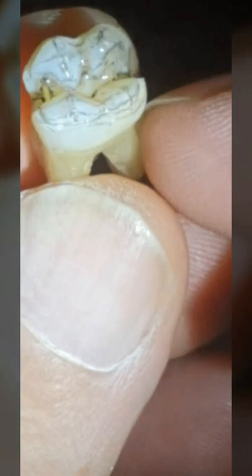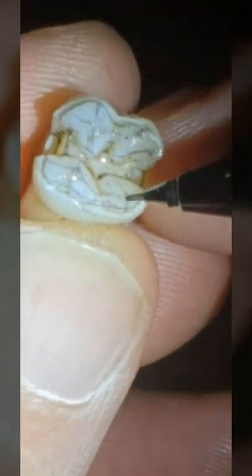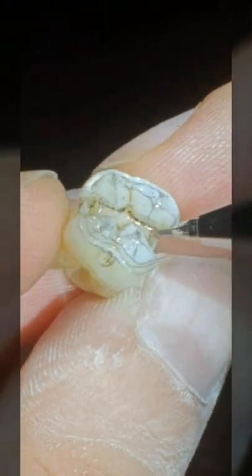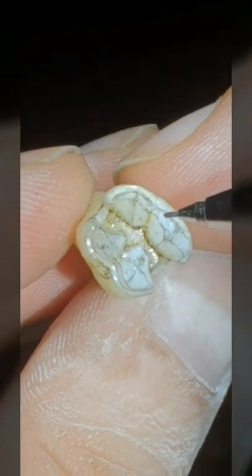So on this preparation what we have is each cusp has at least 4 facets from the cusp tip, 1, 2, 3, 4. Then on the facial it has 2 facets, and in the lingual aspect it also has 2 facets into the box. So it turns out to be 1, 2, 3, 4, 5, 6, 7, 8, at least 8 facets each, that's 16.